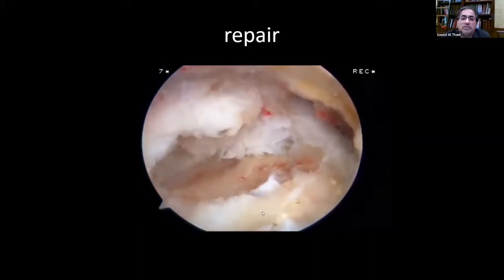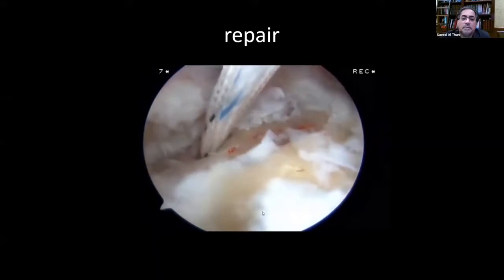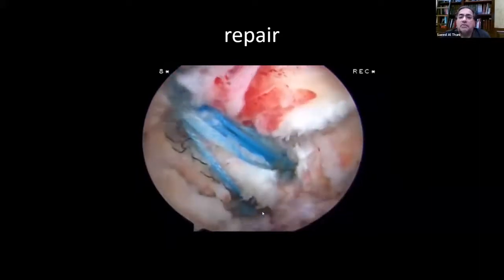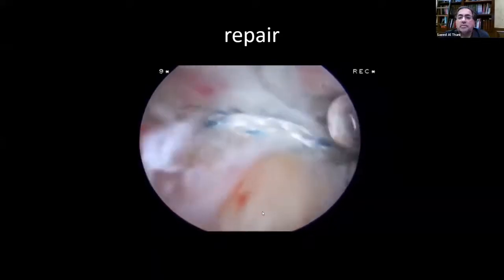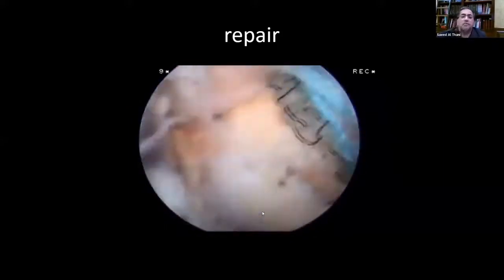especially with this massive tear. So we put an anchor there and repair it there. We found there's a flap in the middle, so we add one more tape to close that. We use tape to close the middle. So this is the overall repair.